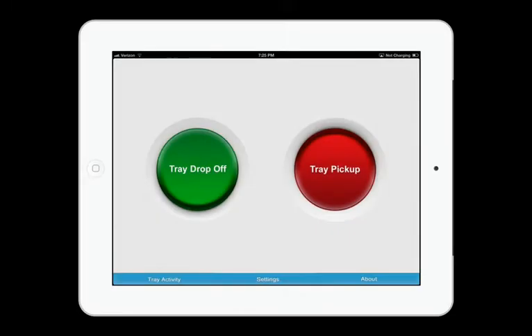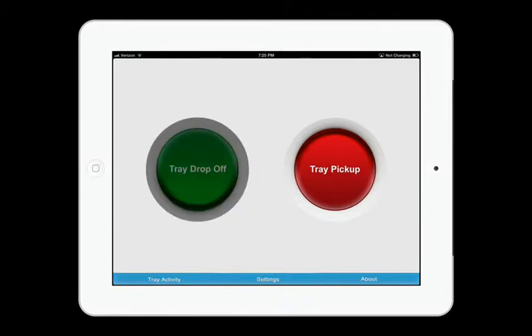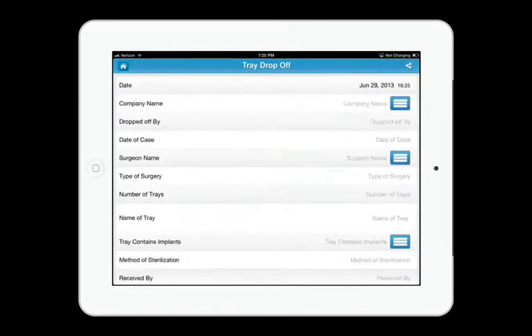The TrayTracks system allows you to upgrade from a paper system to an electronic system for managing your vendor loaner trays. When a vendor comes to your facility to drop off trays, instead of filling out a loaner sheet, they're now going to take the iPad and press the tray drop off button.